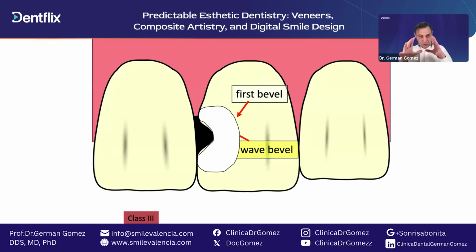Okay, good. Let's dive into how we have to bevel and do several things to get invisible or predictable aesthetics in front fillings.